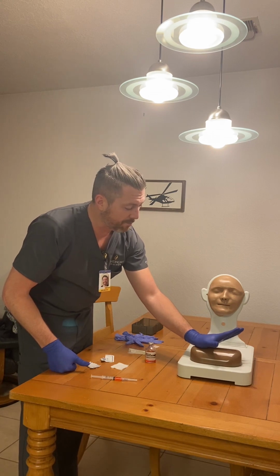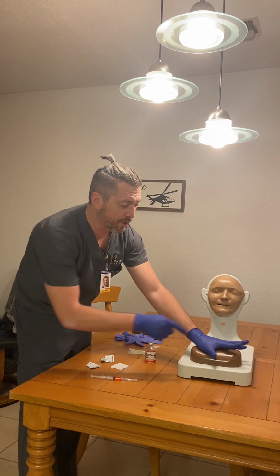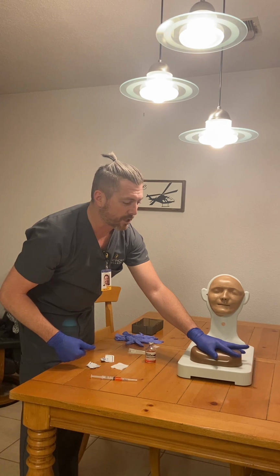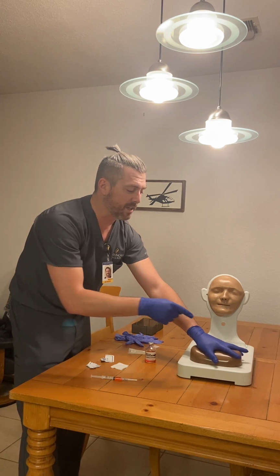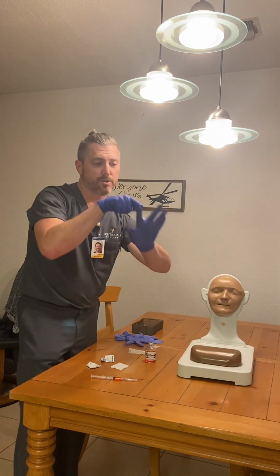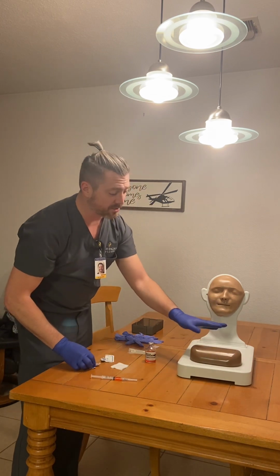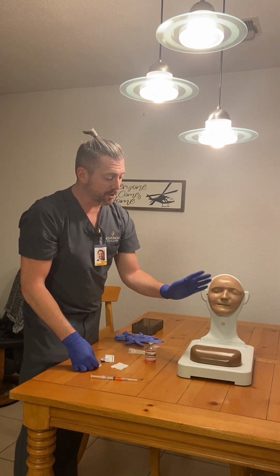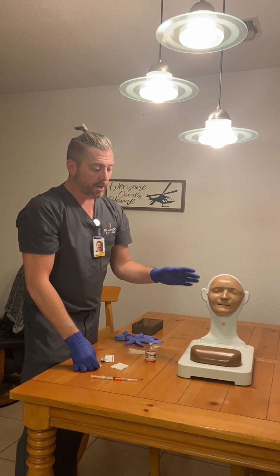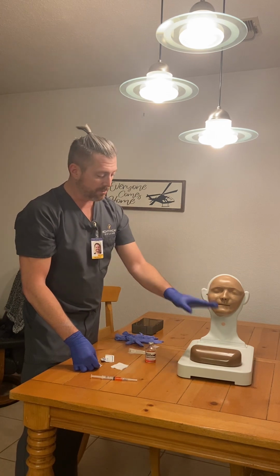So, heel of the palm on the greater trochanter, and then we use our index finger to point towards the anterior iliac crest. We're going to be making a V right here, and in between the V is our target. Right there between our fingers is our target. Now I'm going to assess the site, making sure there's no swelling, redness, tenderness, or edema. If there is, or if this is a site that's too commonly used, we would use a different site, but this site looks great.